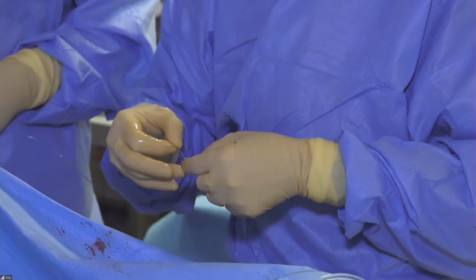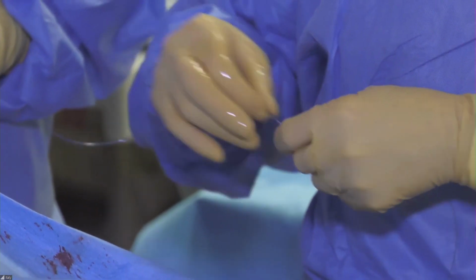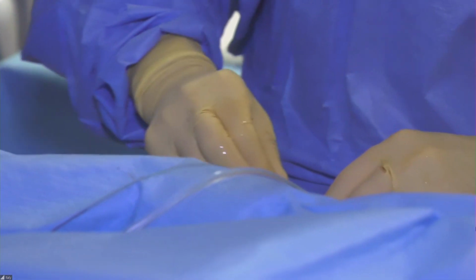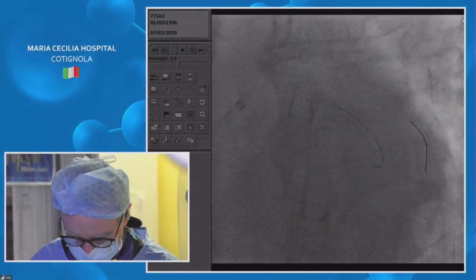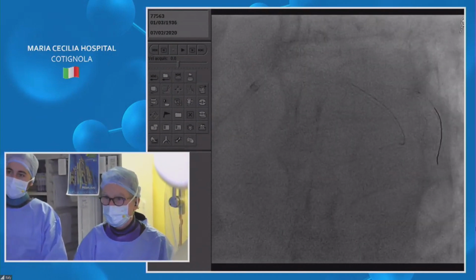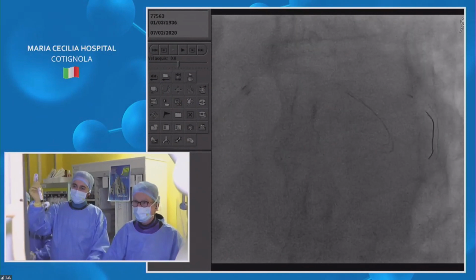2.25 to 3.0, yeah, it's something different. Is this a Supraflex or Cruz? So this is Cruz. We'll see if it goes through the other stent. They claim good pushability, so we will see. Let's test. This is a real good test, also because there's a double curve.